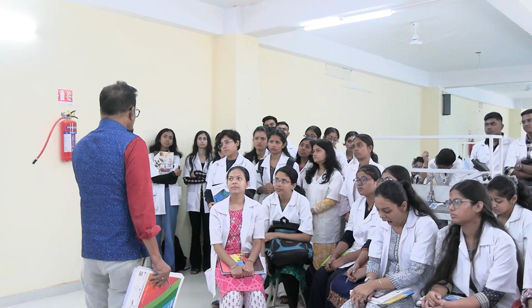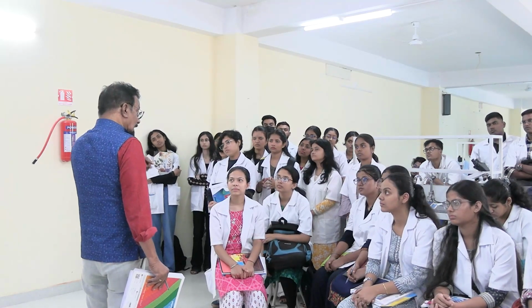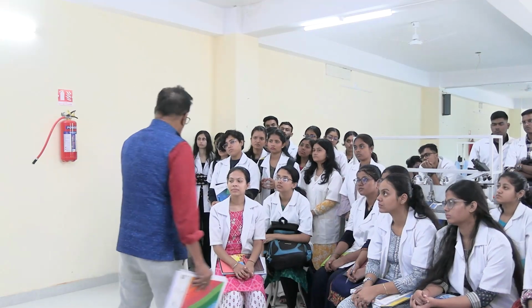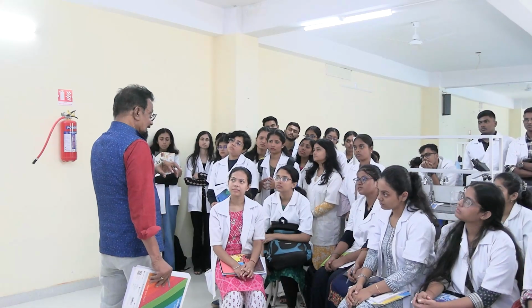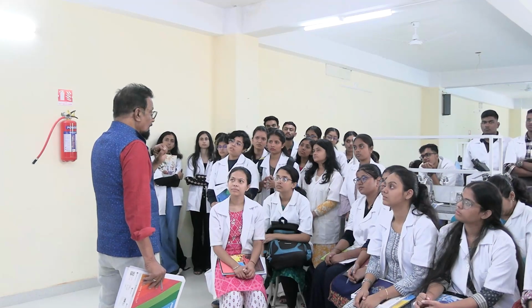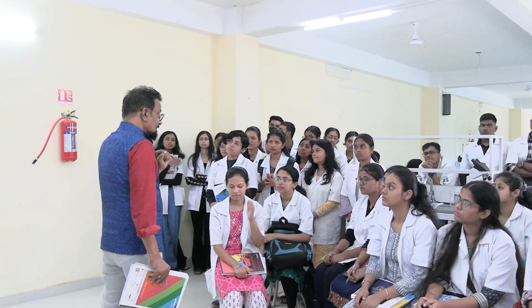Let's see what the numbers of neutrophils are. Out of these 100, how many are neutrophils, how many are lymphocytes, how many are monocytes, how many are basophils? This number out of 100 is called the differential count of each variety.